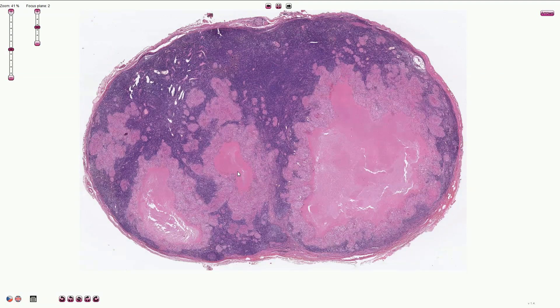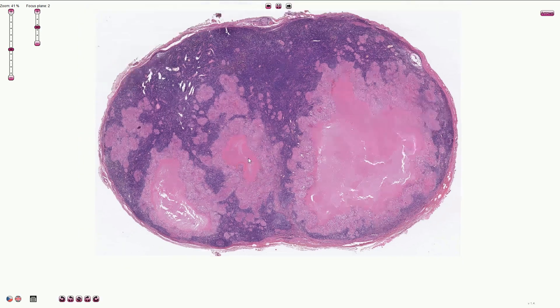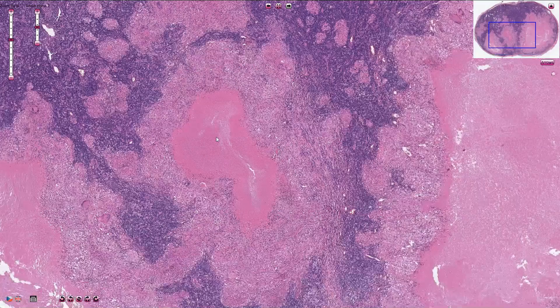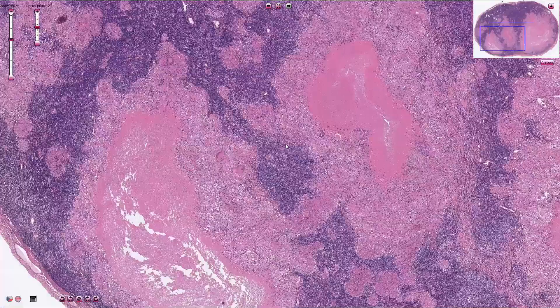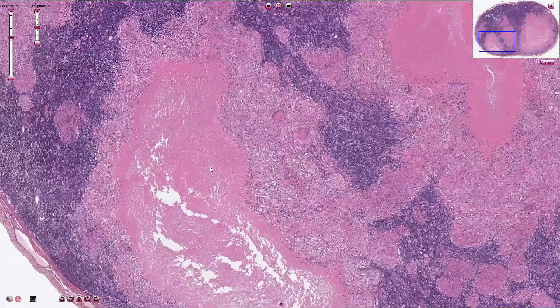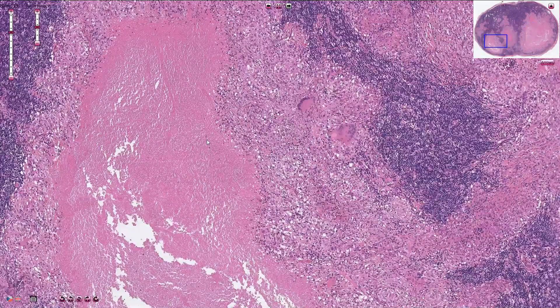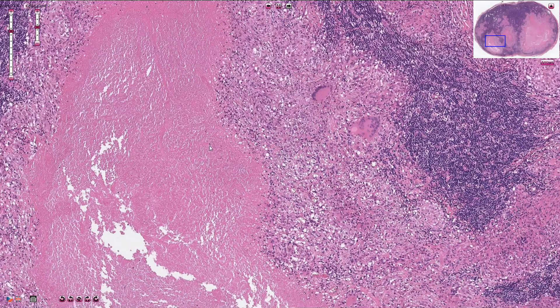It's called caseous necrosis, or cheese-like necrosis, because it resembles cottage cheese on gross examination. On higher magnification we can see that there are no nuclei inside the caseous necrosis. Sometimes we can identify chromatin sprinkle, which is made out of destroyed nuclei — those small blue dots are chromatin.